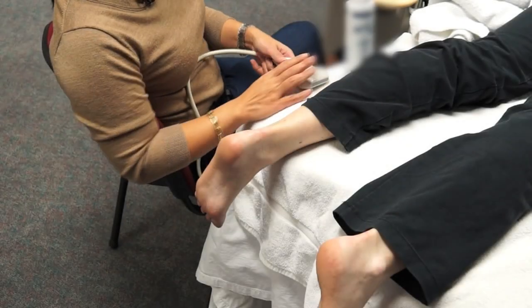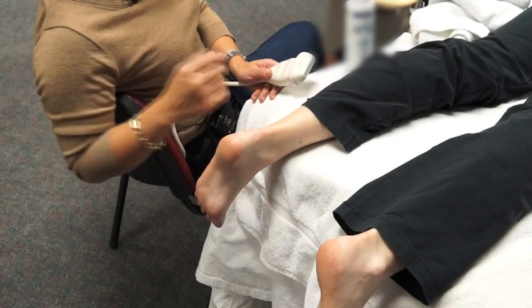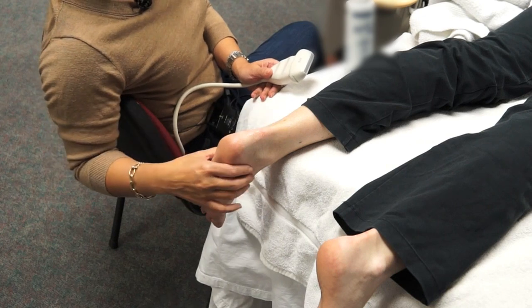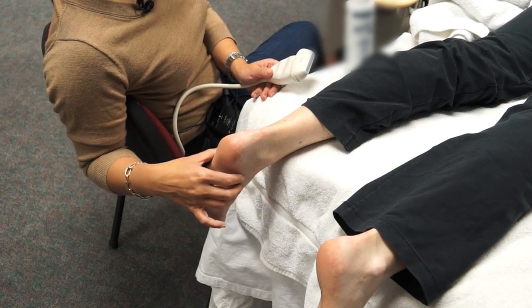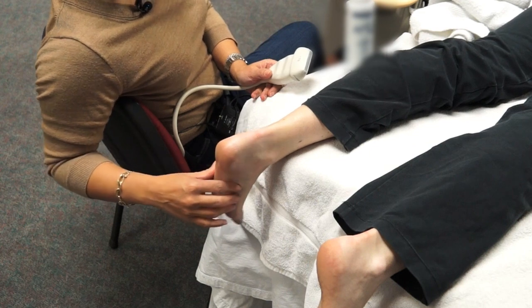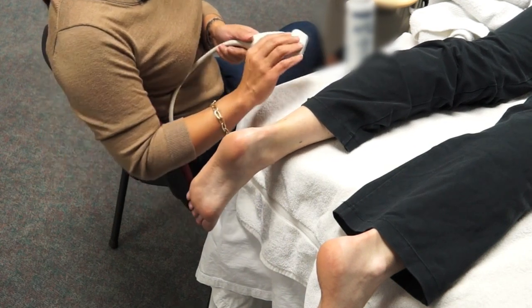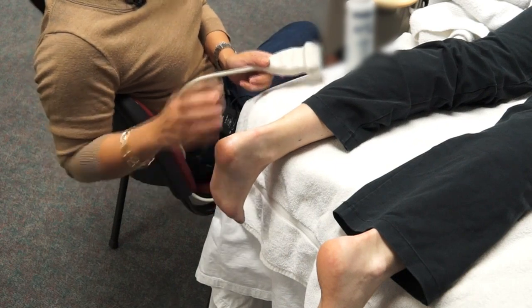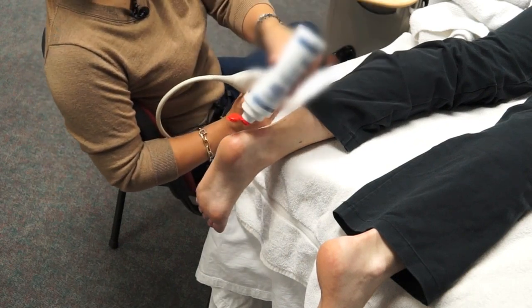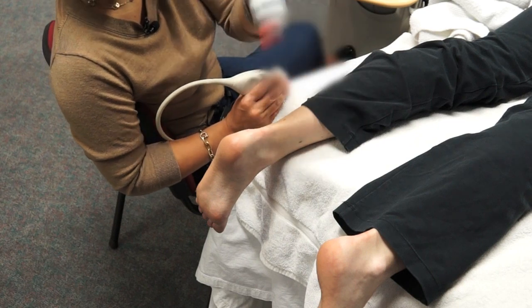Okay, now last, we'll be looking at the posterior ankle, and the best position for this is to have the patient prone with their foot extending off the stretcher. This allows you to image and have the patient plantar flex and dorsiflex to look at the Achilles tendon. And we'll have the patient relaxed for now, and we're going to look at the Achilles tendon.